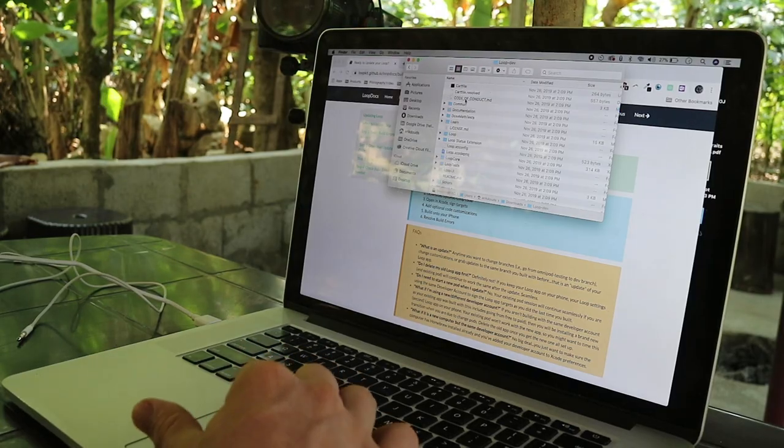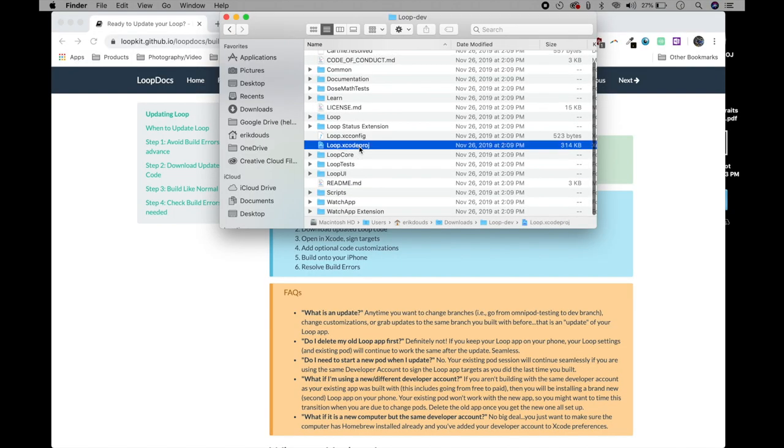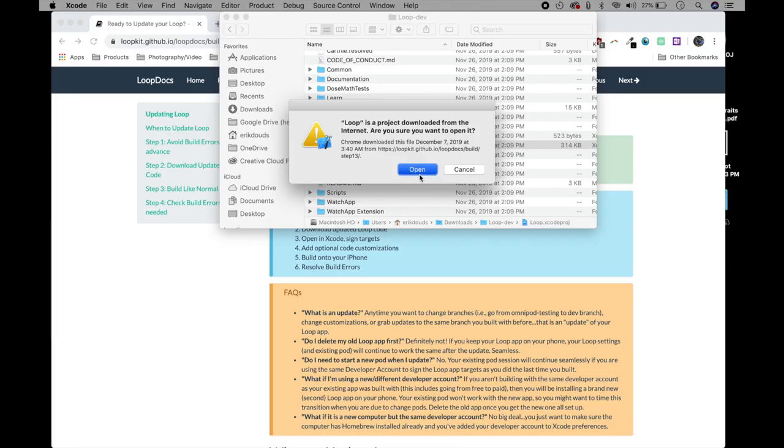A folder will appear and from there you open up the Xcode project file. Now just follow all the same steps you would normally take for installing Loop. If you have any questions go to the Loop docs, but basically you're finding your phone, adding your Apple developer account, authenticating, identifying everything, and then running the app.